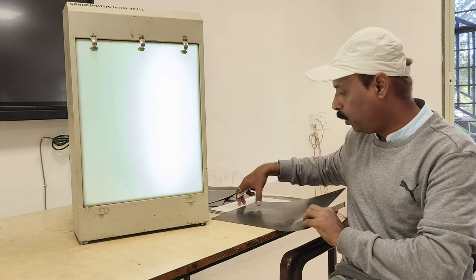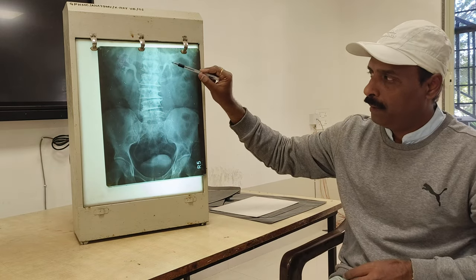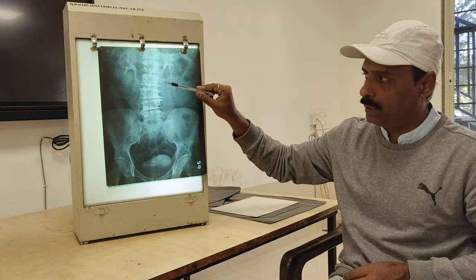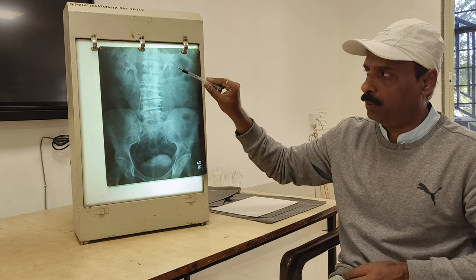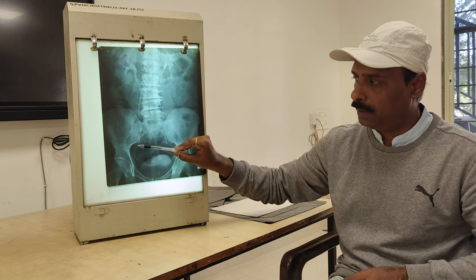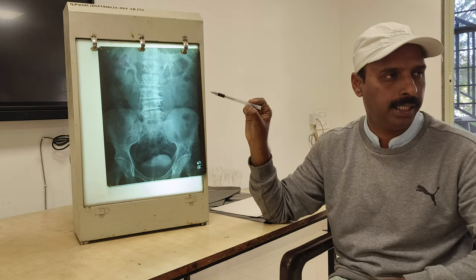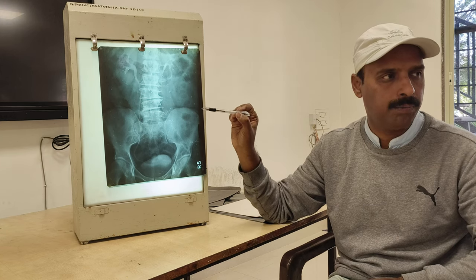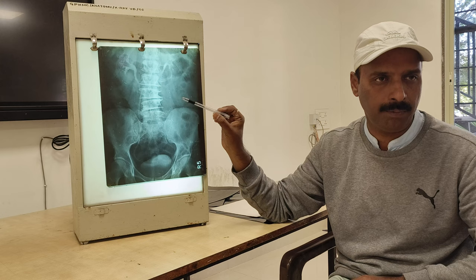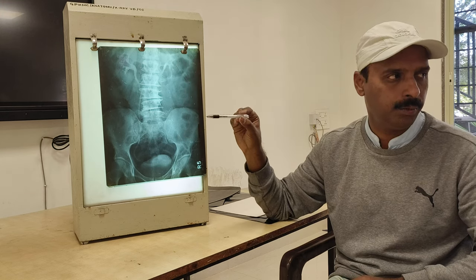Next comes one more example of identifying intravenous pyelography. Here you can see the normal excretion through the ureter on both sides, the shadows of the right and left kidneys, and the urinary bladder. You can get the total tracing of the ureter on both sides. This is a contrast X-ray of intravenous pyelography. You can write IVP or intravenous pyelography, a contrast variety of X-ray, not plain. Don't write KUB, because you identify it by the contrast media used.